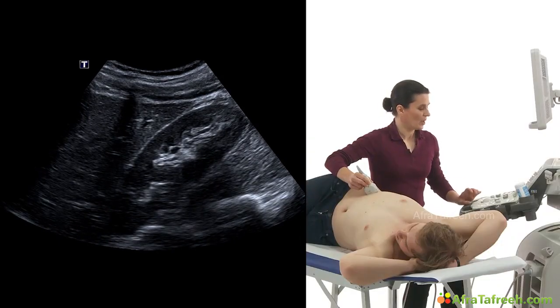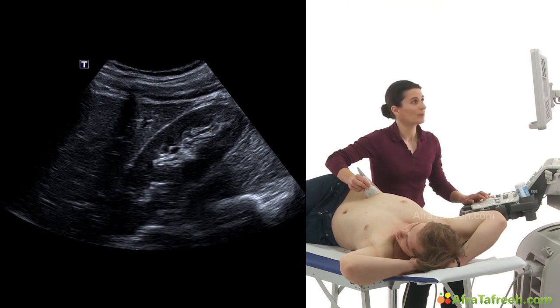Okay, so now we've got the renal pelvis in the center of our picture, over here. We can see it's hyperechoic, quite bright, as we already know. And around it, we've got the renal parenchyma, very clearly seen here. And also the renal capsule, which can be beautifully viewed over here.